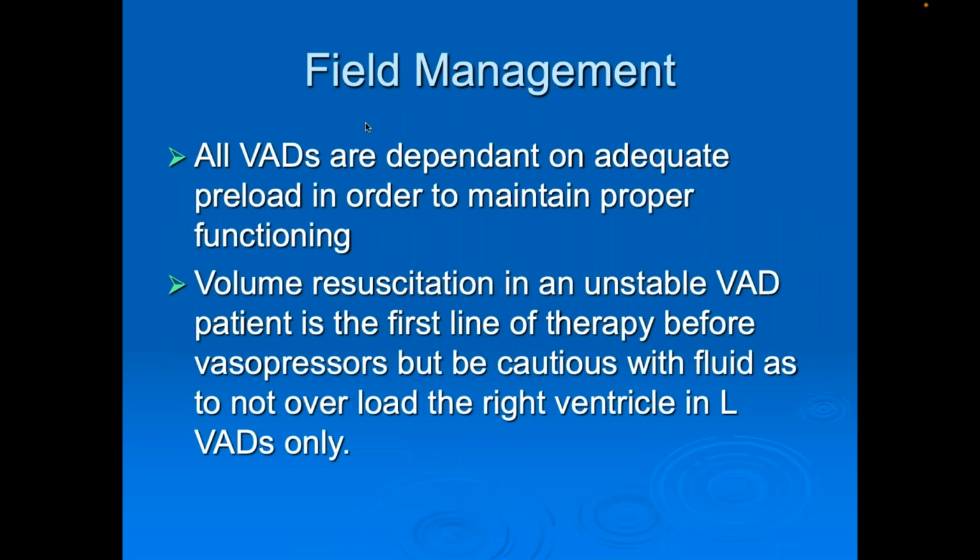Field management. All ventricular assist devices are dependent on adequate preload in order to maintain proper functioning. Therefore, it may require IV therapy and saline administration. Volume resuscitation in an unstable VAD patient is the first line of therapy before vasopressors, but be cautious with the fluid, as we do not want to overload the right ventricle in LVADs only.